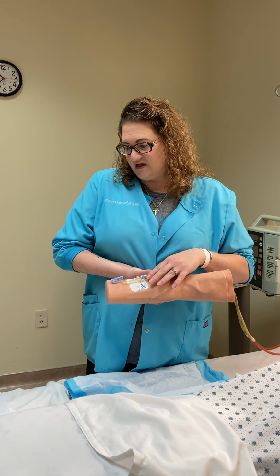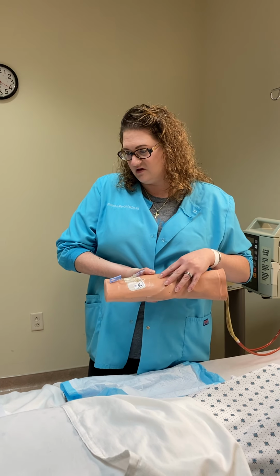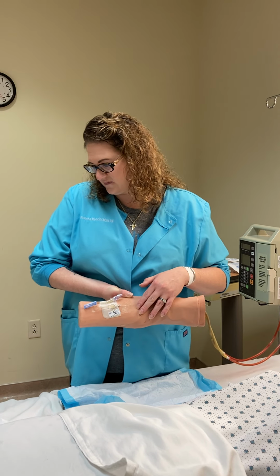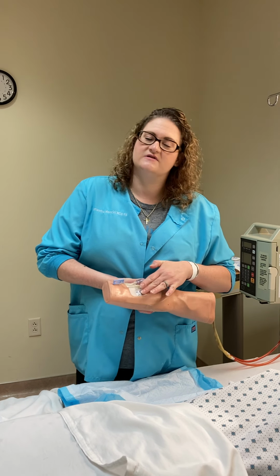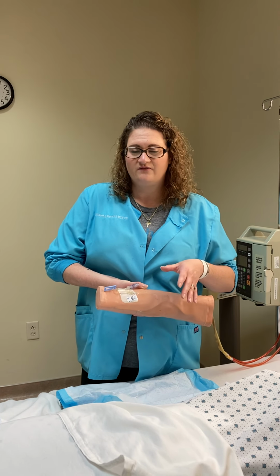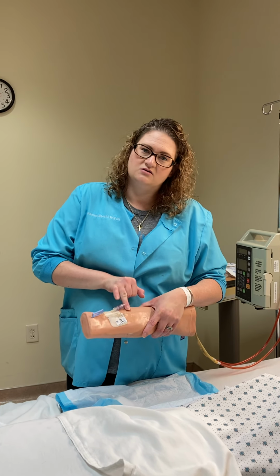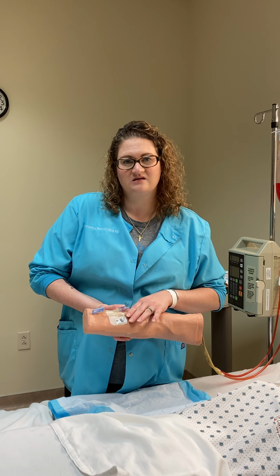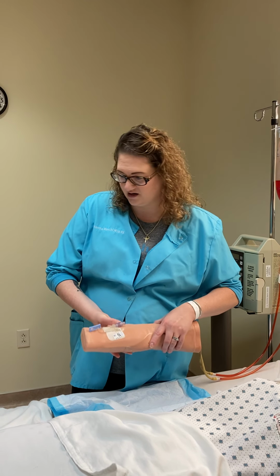We don't want to have a bunch of edema. We don't want to see erythema. The dressing should be dry, clean, and intact, noting again the date that it was placed. In a lot of facilities, 72 to 96 hours is the duration before you need to switch, but follow whatever your facility's policy is. I don't notice anything out of the normal as far as appearance, and when I palpate, I don't feel any warmth, and the patient's not complaining of any pain or tenderness at that area.